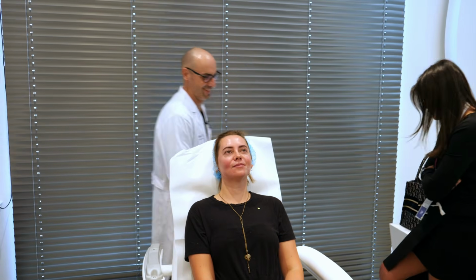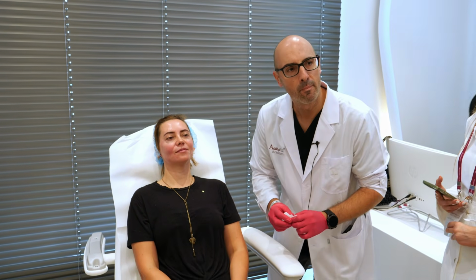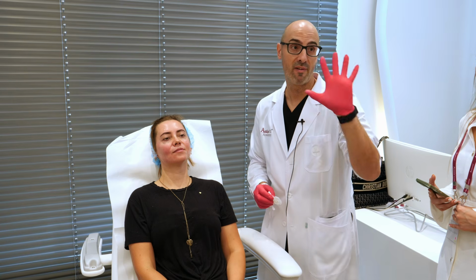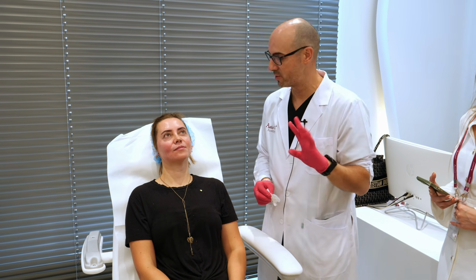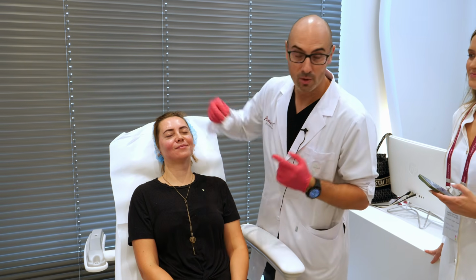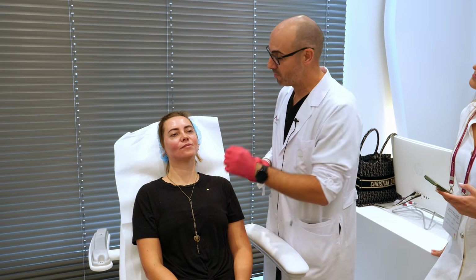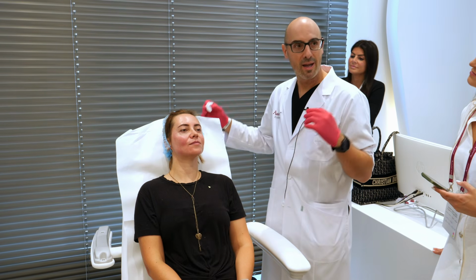Great. How much product have you used till now? 6 milliliters. A complete vial with the dilution of 5 water for injection and 1 of lidocaine 2%. Is it too much? No. We have put 6 milliliters in her face, but it's not a heavy face.